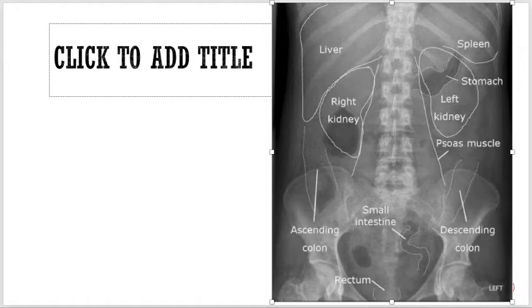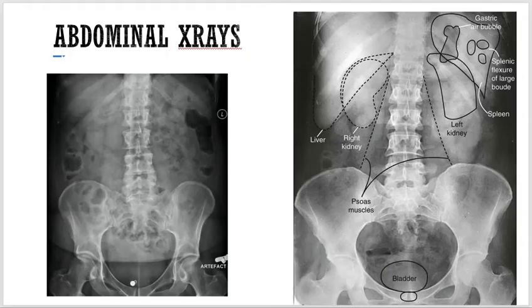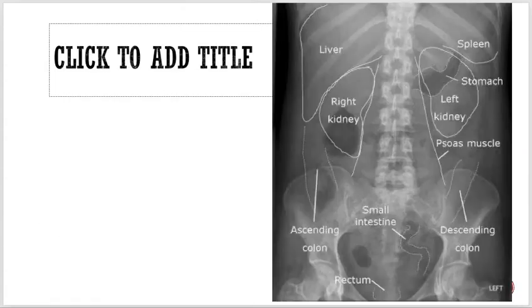How we interpret abdominal X-ray is simply, we are working with the same things, whitish and grayish and blackish colors, or you can say the shades of different things. So, for example, this is black color, this is white color, and there is a lot of gray color. Okay, so black basically is gas, or you can say intraluminal gas. See, intraluminal gas. This is the stomach, so intra stomach gas. This is small intestine gas in that.